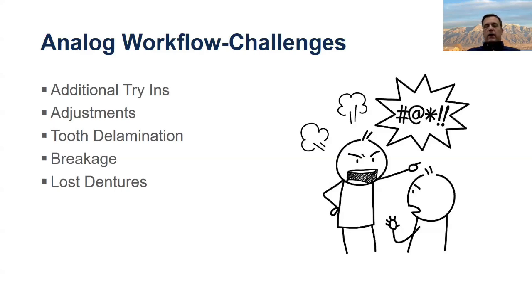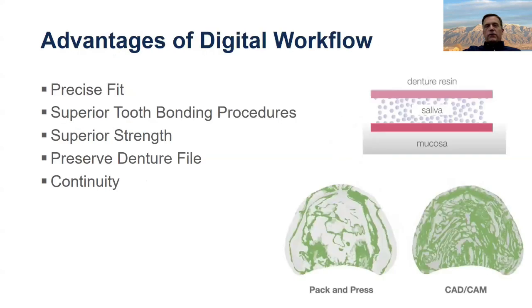And then last but not least, you get your lost dentures. You've worked hard, you've gotten the case done, and you're like, all right, I got something awesome. And then the patient loses it, and you're like, oh man, you think about everything you went through and you got to start all over again. Another source of frustration. So let's talk about how digital workflows can eliminate some of these problems and make the case work better for you.